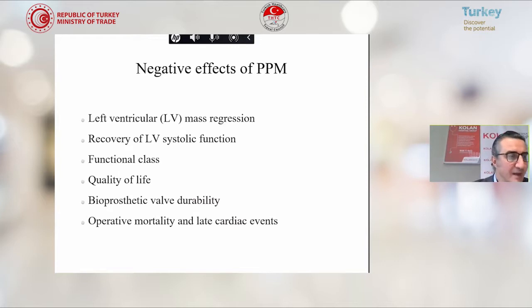It has been shown that PPM following aortic valve replacement has negative effects on left ventricular mass regression, recovery of left ventricular systolic function, functional class, quality of life, and bioprosthetic valve durability.